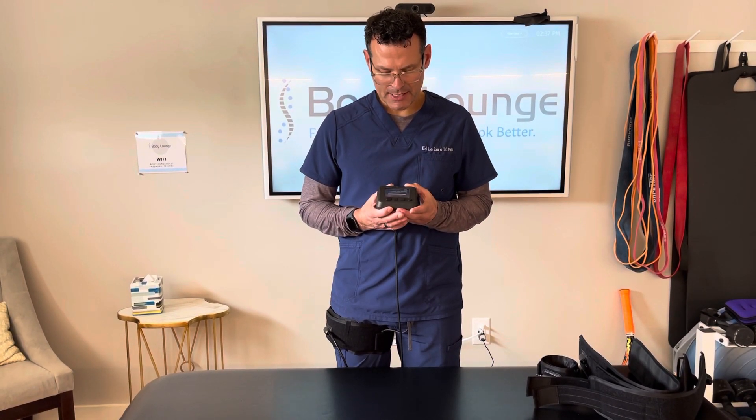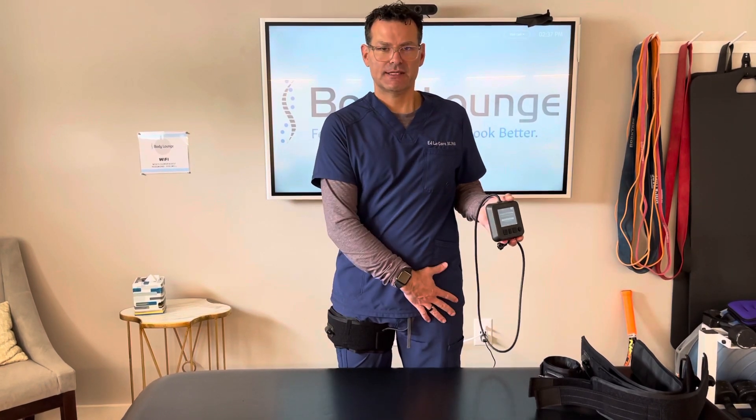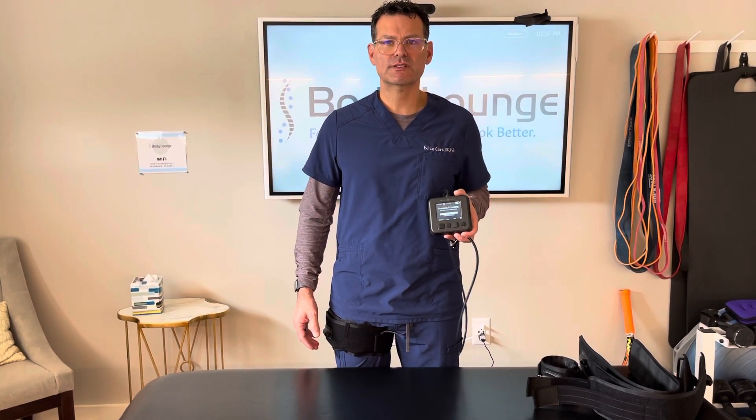Then I can disconnect and now I can start my exercise, or I could establish my pressure on the other side as well. So that's how to utilize the Generation 3 cuff in the lower extremity.